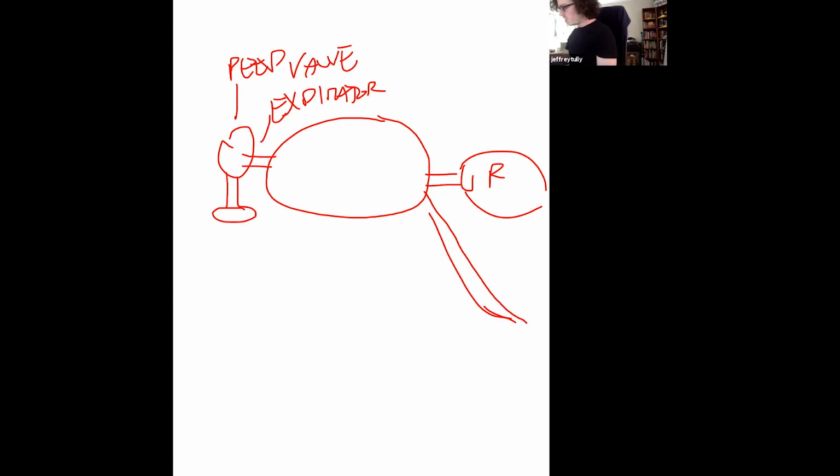So this is a ventilator. This is something that I use to transport patients to and from the ICU and OR, or in an emergency when we're trying to resuscitate somebody. And obviously by squeezing this bag, you generate the pressure.